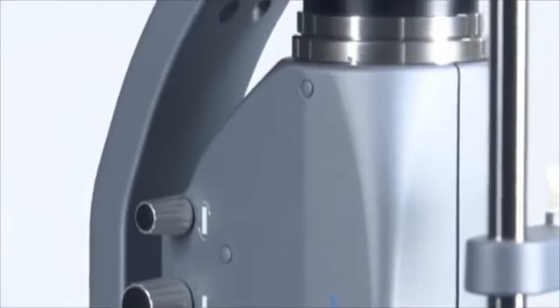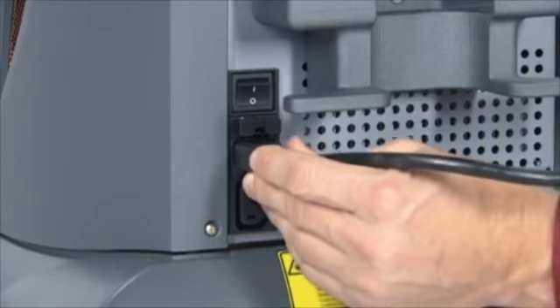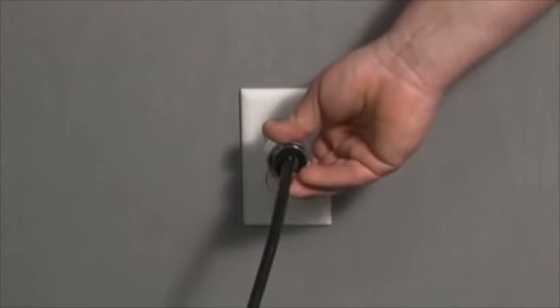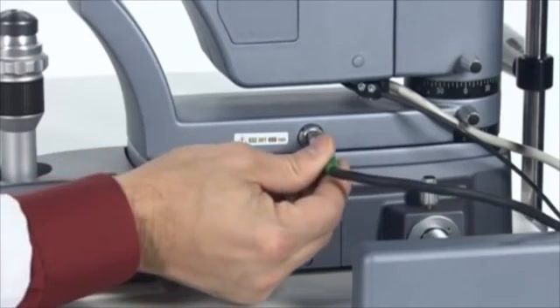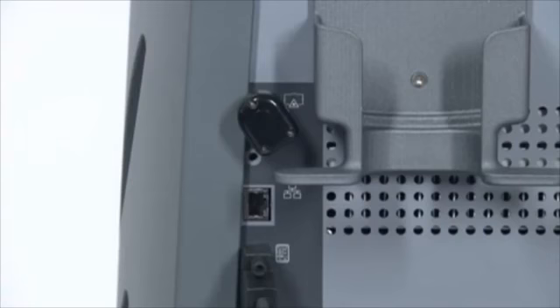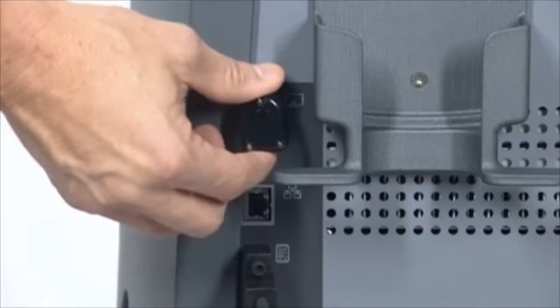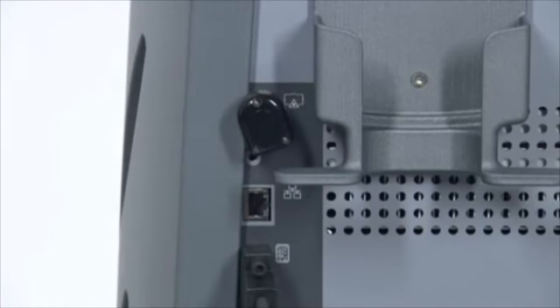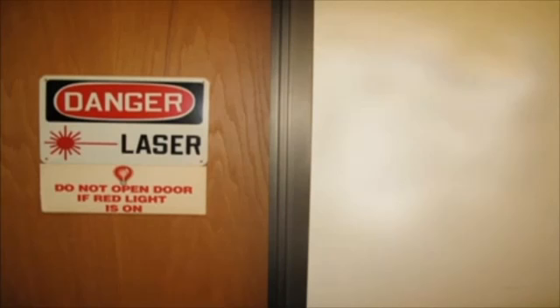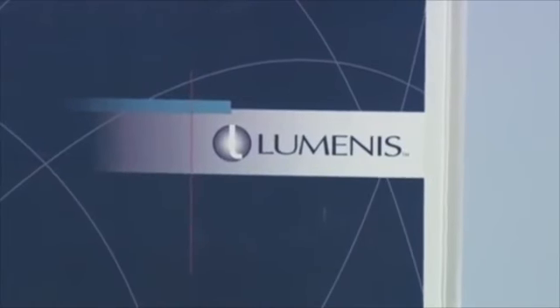If the instrument fails to operate properly, first, please check for the following items. Verify that the electrical disconnect switch, the circuit breaker, is turned on. Verify that the laser is on and properly connected to an electrical service outlet. Verify that the delivery system is properly connected. If the external door interlock is used in conjunction with a remote switch, verify that the external door interlock plug is inserted in the external door interlock receptacle. Close the interlocked door.